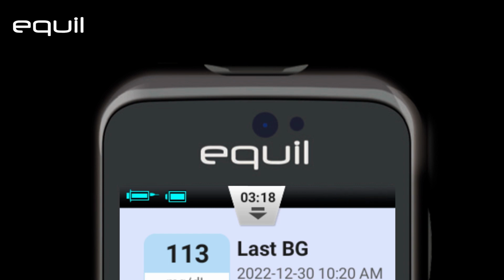You can see the PDA status, which is green on the right. This icon displays the state of the PDA in terms of battery charging in different degrees. When it's charging, it looks like this. There is also another icon that shows the wireless signal strength in 3 different degrees. In the event of a total disconnect, you'll see this.